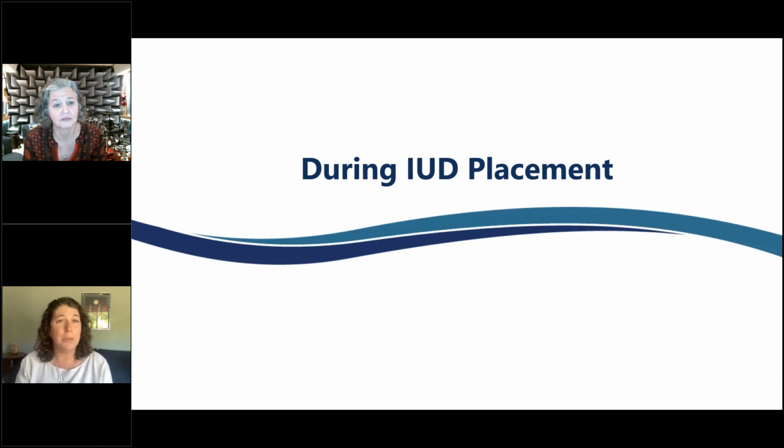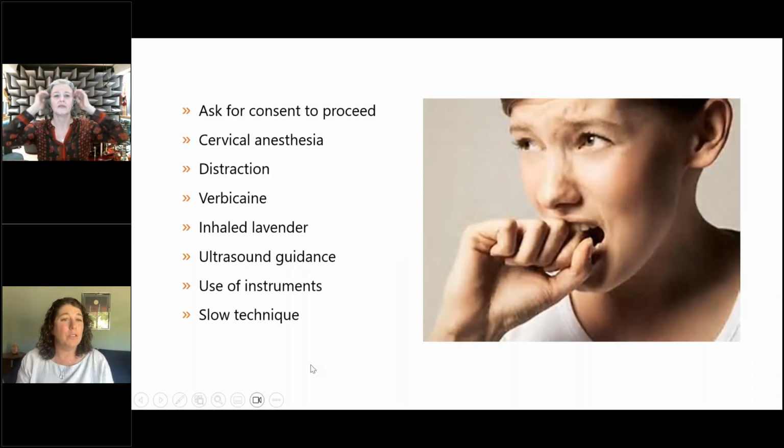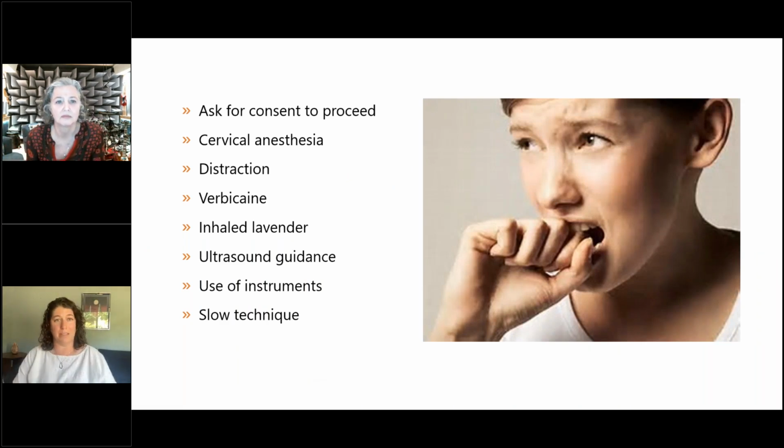So now we're going to talk a little bit about things we can do during the actual procedure itself. So if you want to go to the next slide. We mentioned some of these already, but obviously we're asking for consent before we're moving forward with doing the procedure. We're going to talk specifically about cervical blocks, because I know many of you are excited to talk about that. We've mentioned distraction, verbicaine, aromatherapy. If you have access to an ultrasound and can do this under ultrasound guidance, that is something that can be utilized because it can help us navigate through the os and minimize some discomfort.